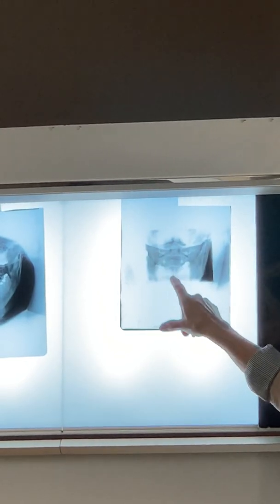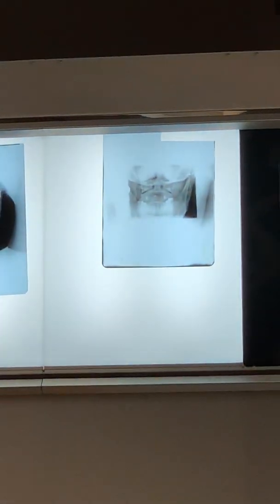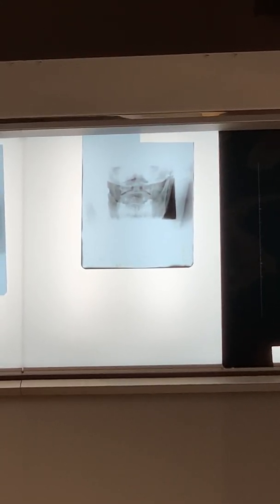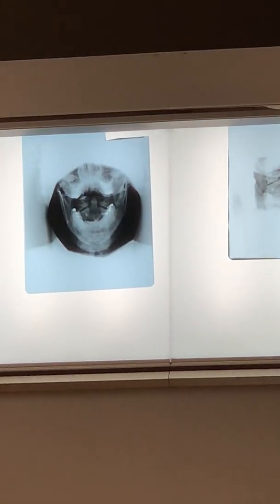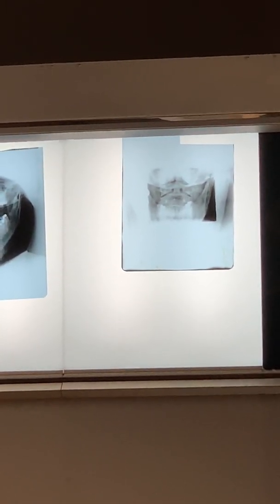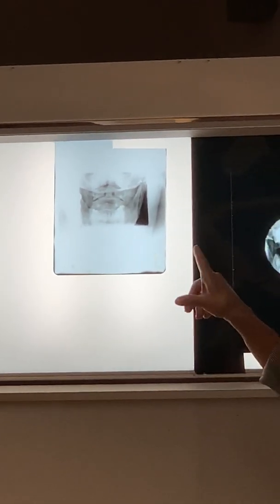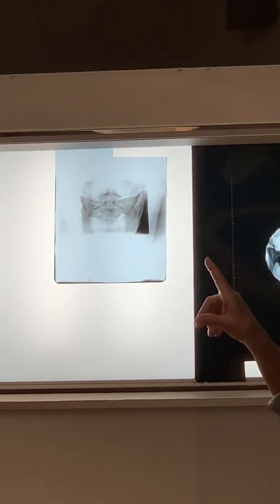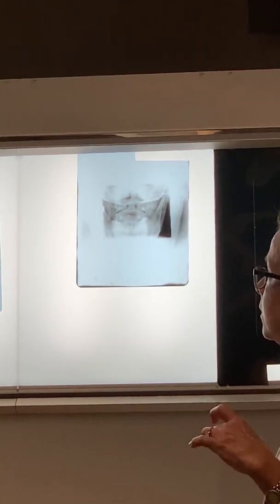They're going to have to open their mouth wider because the teeth aren't too far away either. See how close that is? So either they have to open their mouth wider, or you have to do, what's the alternative? You have to do the Fuchs, which we'll get to in a minute. Keep in mind, you always have to get these apophyseal joints on the open mouth odontoid because you will not see the apophyseal joints on the Fuchs. The Fuchs is only for the tip, the odontoid process tip. So you always need to see these apophyseal joints.